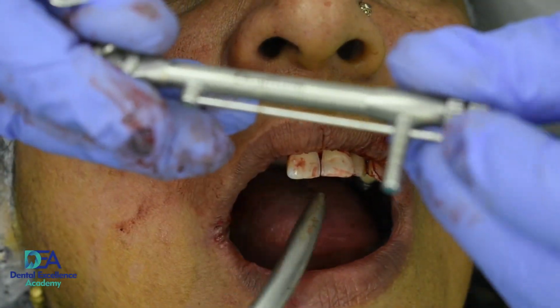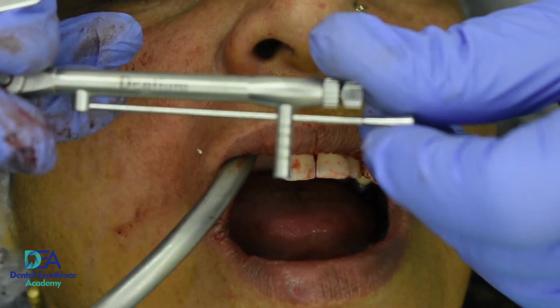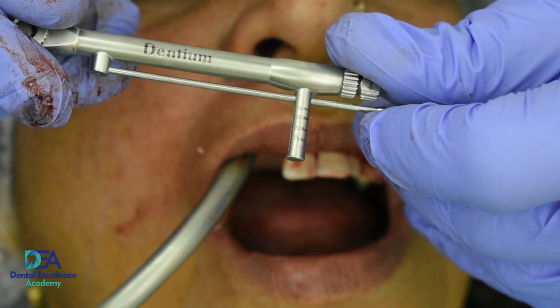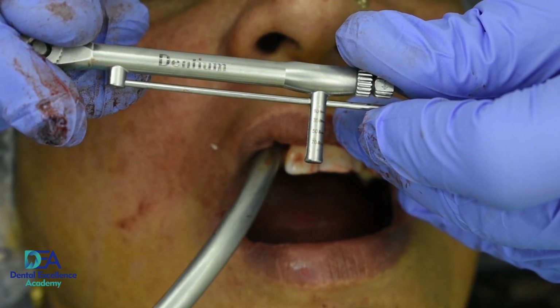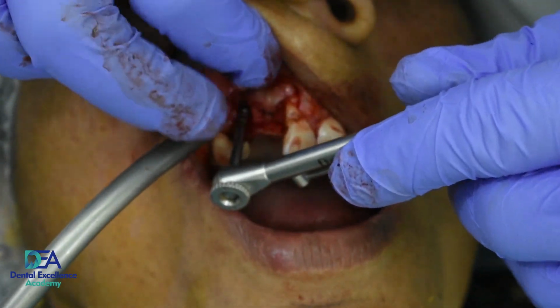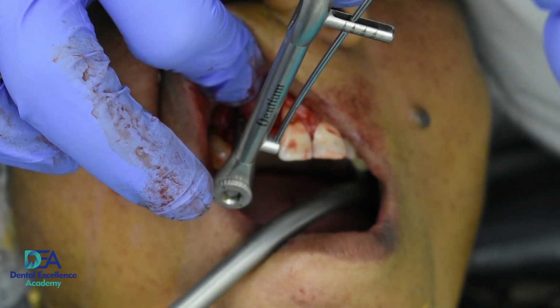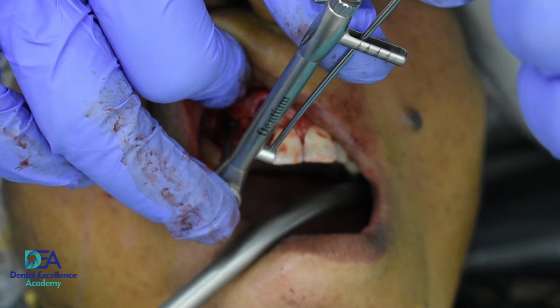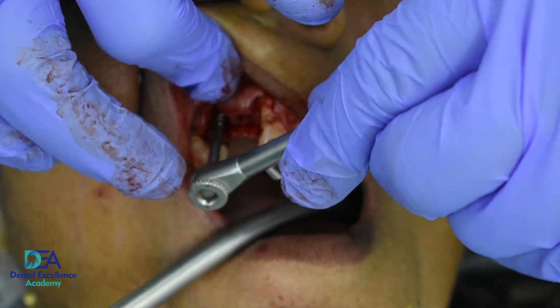Here also I am getting almost 30 to 35 Ncm of torque, and again I am equicrestal on the buccal aspect and subcrestal on the palatal aspect. So see, it is almost 35 to 40 Ncm of torque. This is quite a good torque in the maxillary region because maxillary bone is more porous.